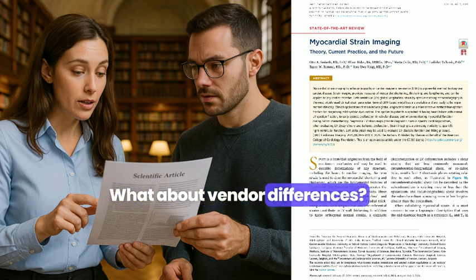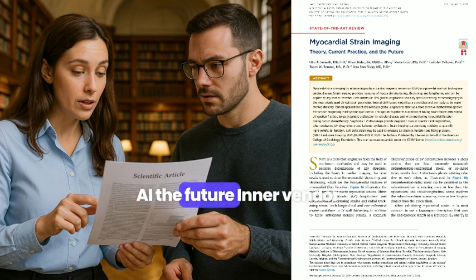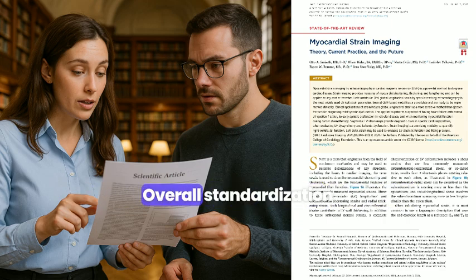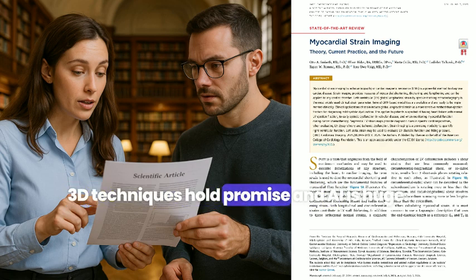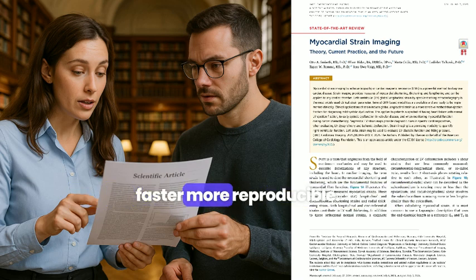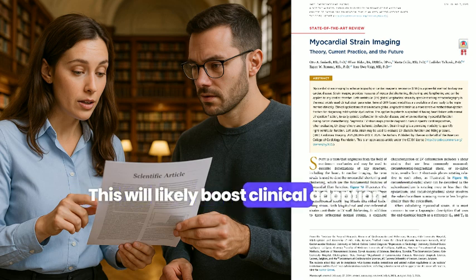What about vendor differences? AI, the future. Inter-vendor differences exist for both STE and CMR FT, though maybe not the dominant source of variability overall. Standardization efforts are ongoing. 3D techniques hold promise. And AI is huge. Automated segmentation and analysis are making measurements faster, more reproducible. This will likely boost clinical adoption.